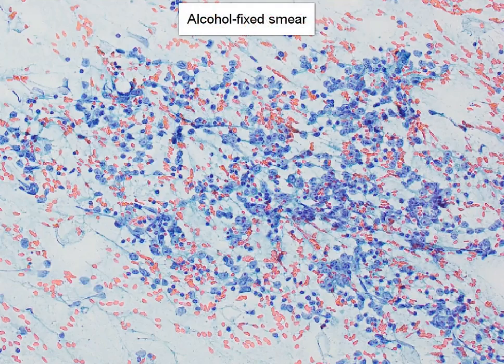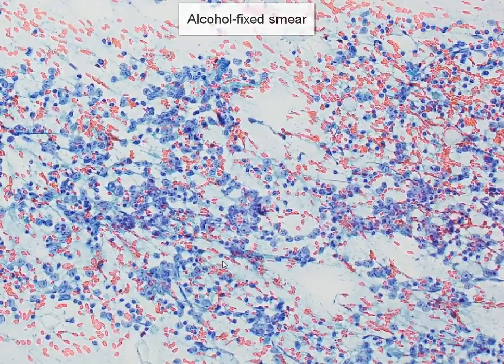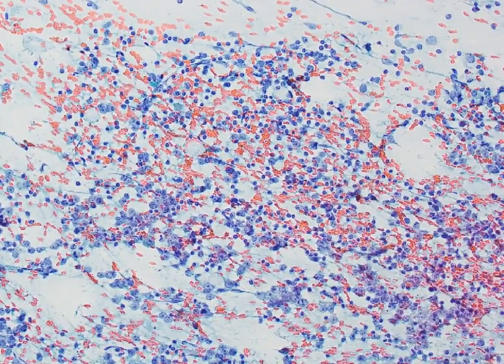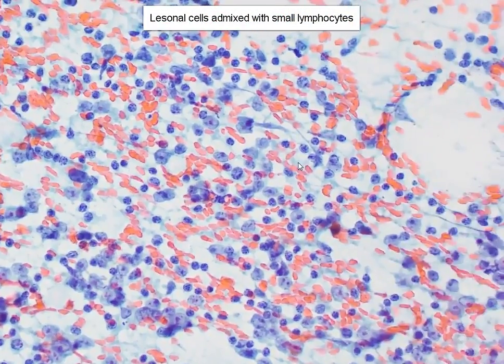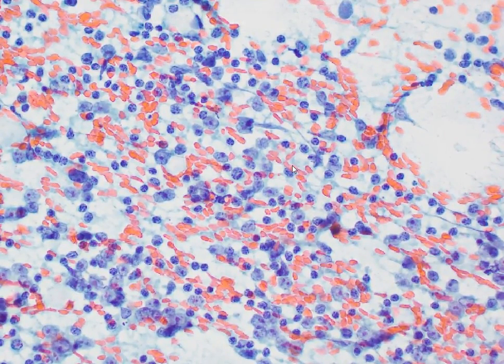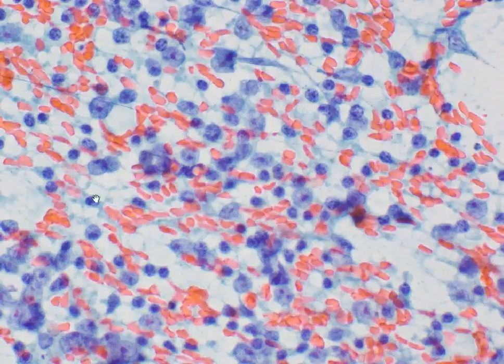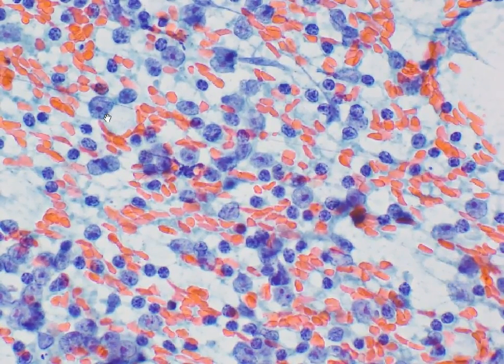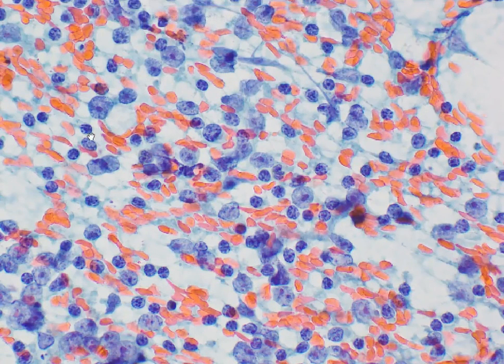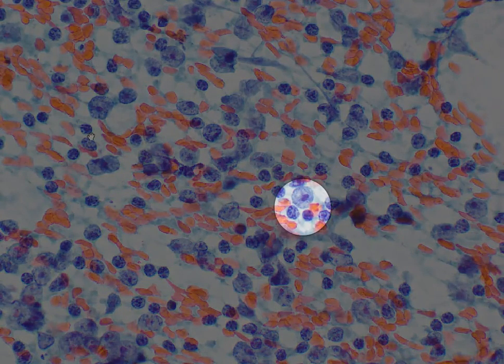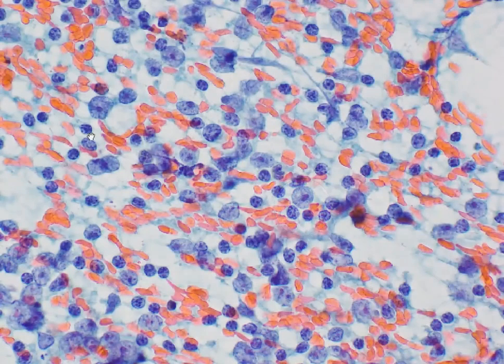This is a medium power view of the alcohol-fixed Papanicolaou-stained smear, and we can see that there are many lesional cells here mixed with lymphocytes in the background. When we compare them, the lesional cells are larger than lymphocytes. They seem to have fairly rounded nuclei, and certainly very prominent nucleoli. This is a good field where we can compare them with the size of a resting lymphocyte, and the nuclei are about perhaps three to four, maybe even five times the size of a resting lymphocyte. The cytoplasm is very indistinct here.